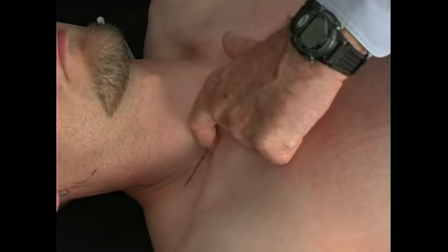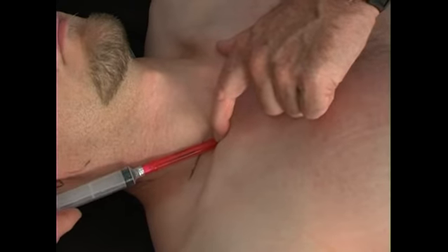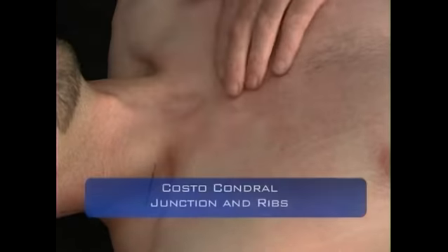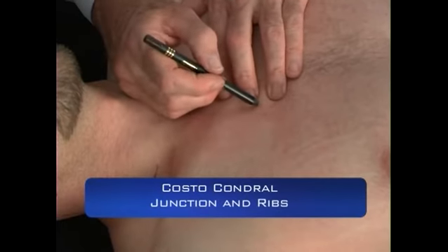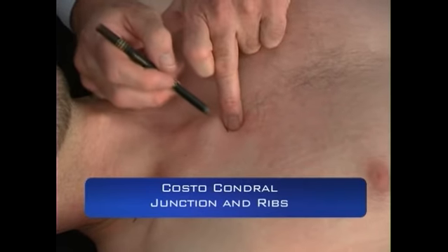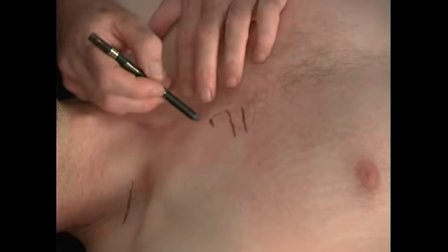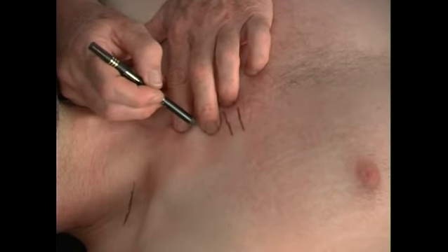The omohyoid muscle attaches right here onto the clavicle, and sometimes that's exquisitely tender, and we can push the tissue down and come into that clavicle and the omohyoid right in there. The ribs, costochondritis: we can carefully palpate down the ribs and find the individual ribs and inject along the costochondral area. There's the rib itself right there, and another rib there.